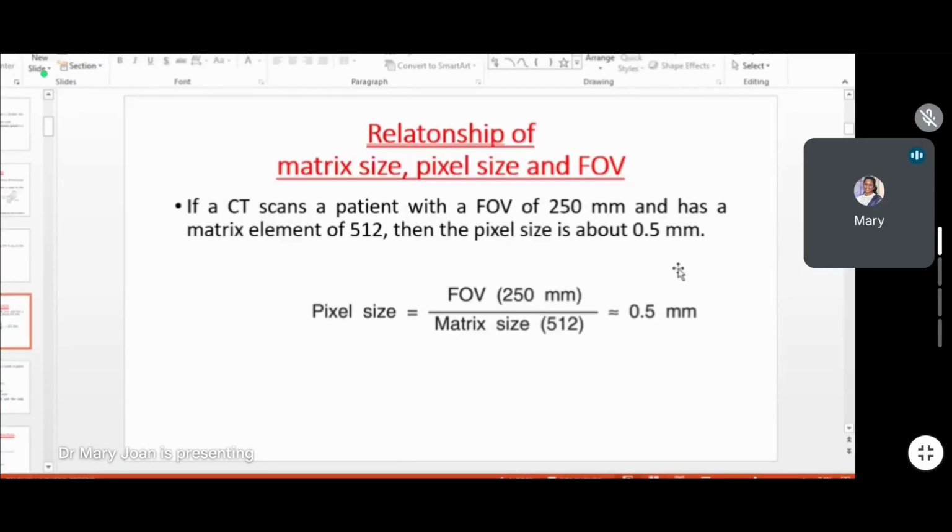When we have a smaller pixel size, we have more information pertaining to that pixel, so that is more preferable. But there needs to be a risk versus benefit, or cost versus benefit analysis, and based on that we fix what is feasible, like how small a pixel is economically feasible to get a good enough image or sufficient information out of the image we are acquiring.